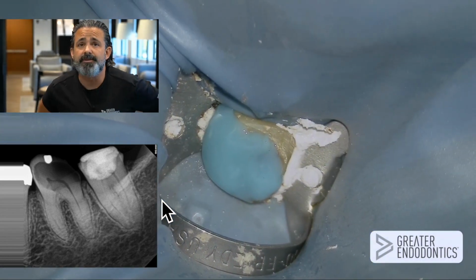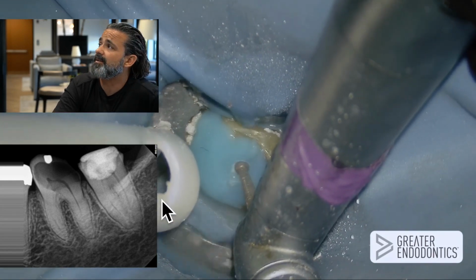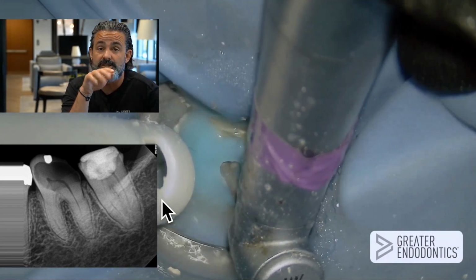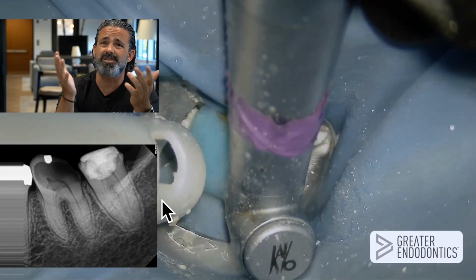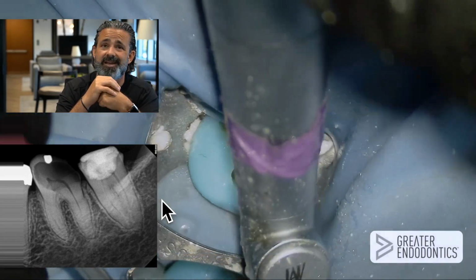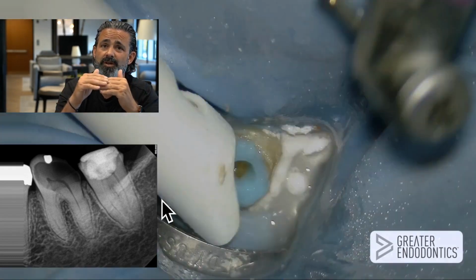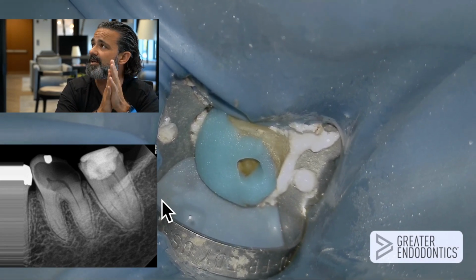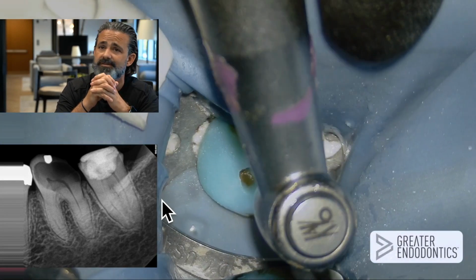Okay, so now that that's cured, I'm going to re-access it, and now I'm just pretending it's a normal tooth. I don't care that it looks like a Smurf, but I'm going to re-access it, and I like to find where the white stuff went, just so I can get my borders, and then just do a traditional access at this point. Now, I'm not necessarily worried it's a compromised tooth. The ninja stuff isn't an issue here because I'm making an access into blue stuff, right? There's no tooth structure above it. I just don't want to gouge that floor and/or overextend where those canals begin in my access form. But I'm not really worried about removing too much tooth structure because it is what it is.